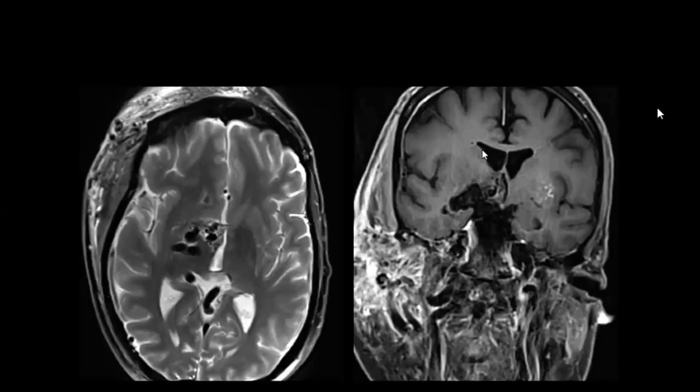Which white matter, the central white matter? This is the area above the ventricles, which is the centrum semiovale, right? This is not that white matter. How will you localize this lesion? I want to give you one important tip: whenever you are describing a lesion, your anatomical concepts should be very strong, because on anatomy no examiner spares a candidate. I know it's a harsh word, but I have to use it.